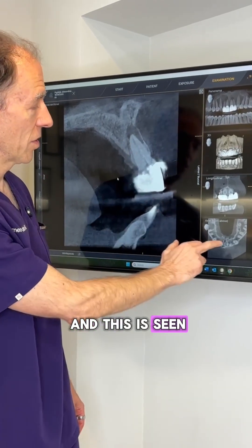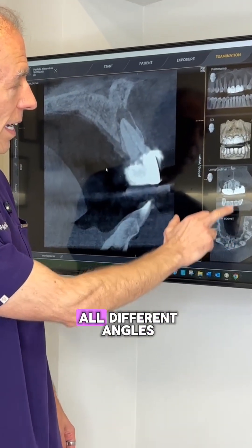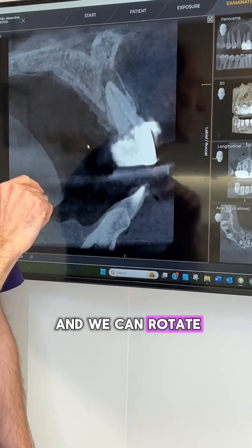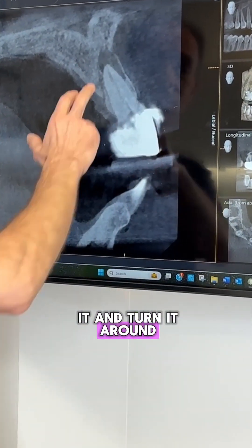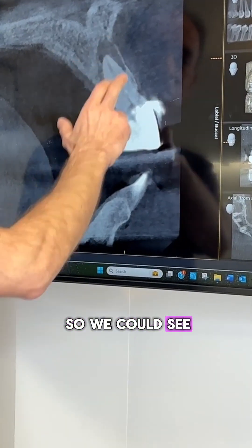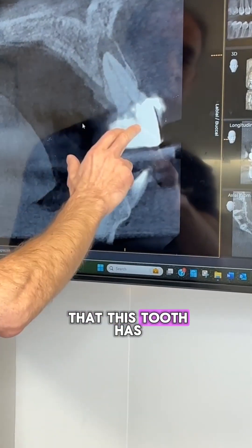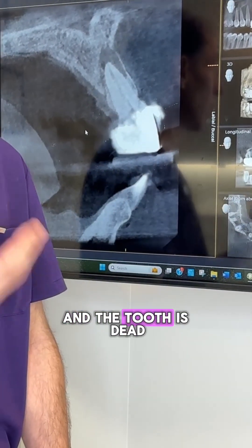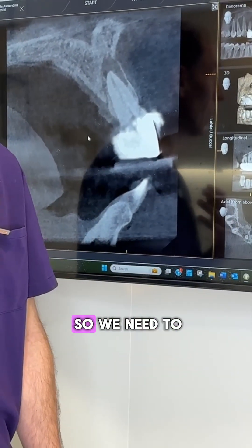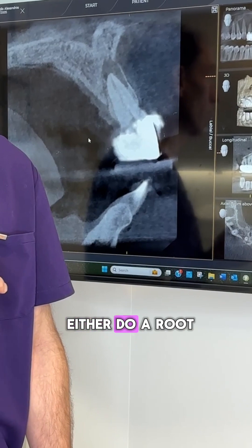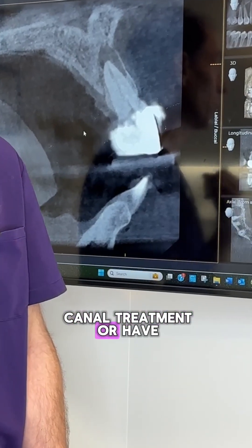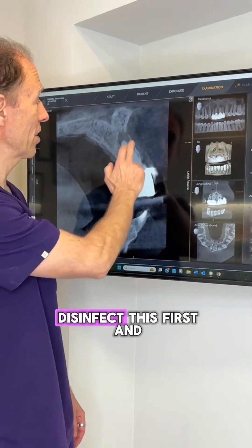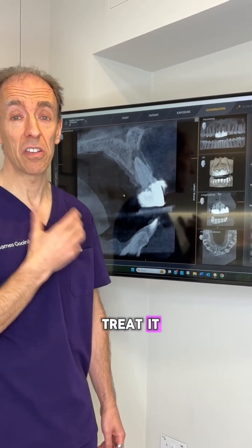And this is seen — you can see it in all different angles, and we can rotate it and turn it around. So we can see that this tooth has actually got an infection, and the tooth is dead. So we need to either do a root canal treatment or have the tooth out — we need to disinfect this first and treat it.